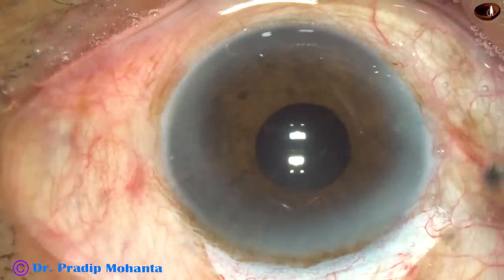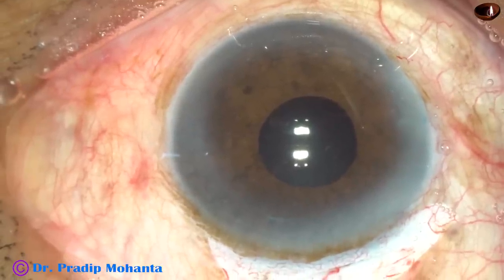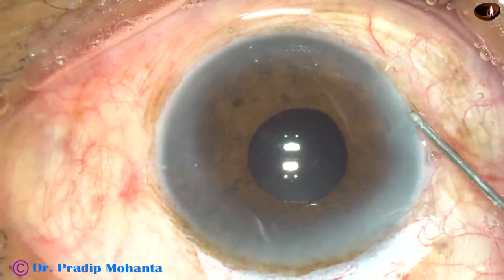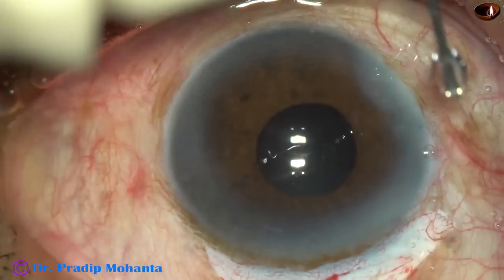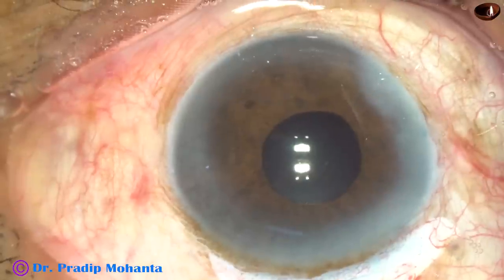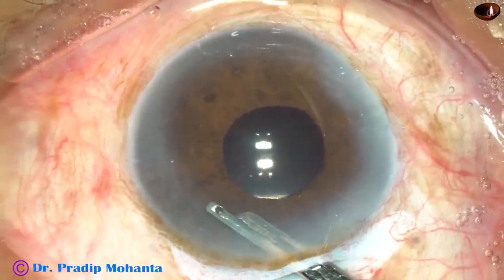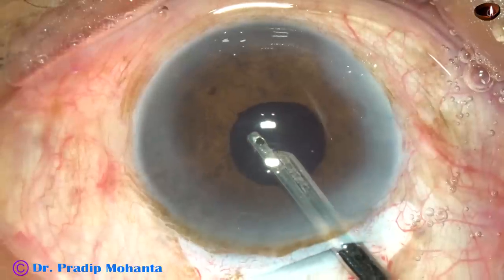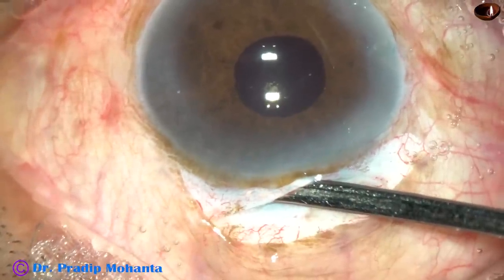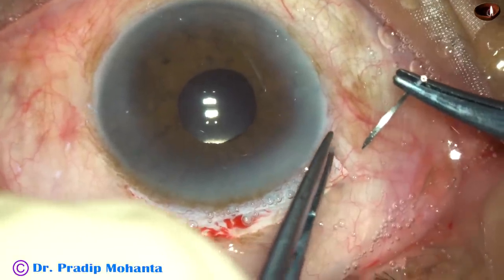After removing the viscoelastic substance, inject some moxifloxacin and hydrate the corneal stroma on either side of the side ports so that the stab incision closes and becomes watertight. All wounds should be watertight at the conclusion of surgery. After hydrating the side port, do a final lavage of the anterior chamber — leave only pure balanced salt solution or Ringer's lactate in the anterior chamber. Form the anterior chamber very nicely — your intraocular portion of the surgery is done.